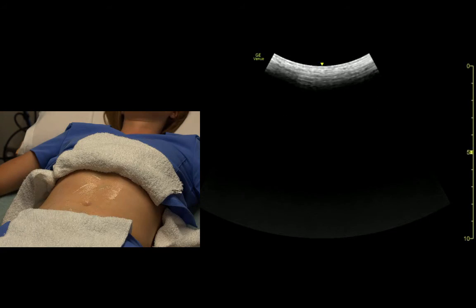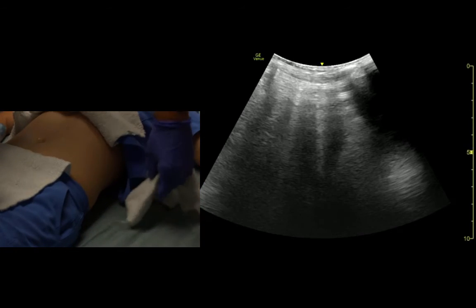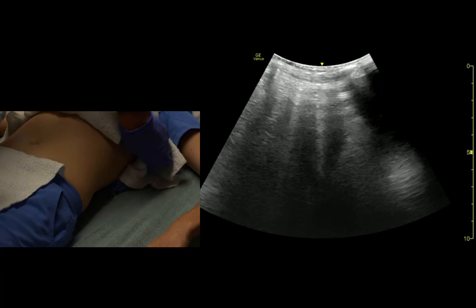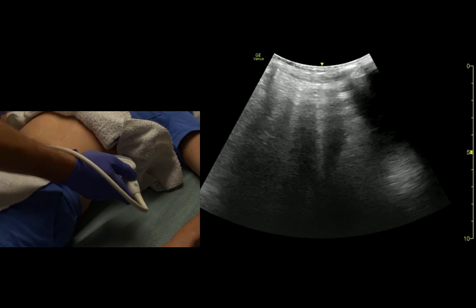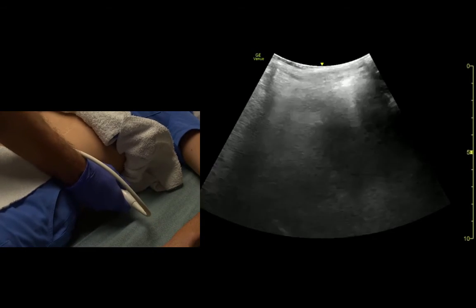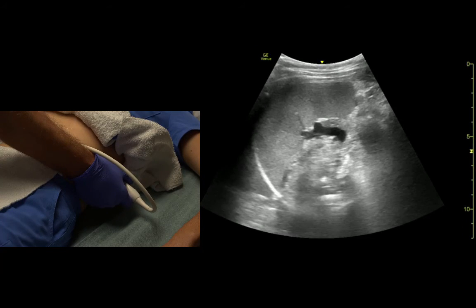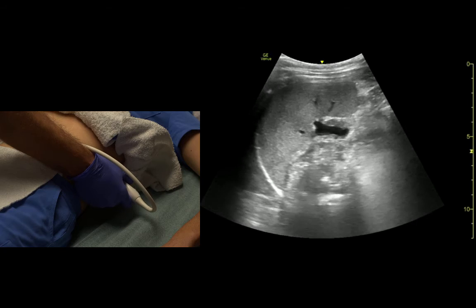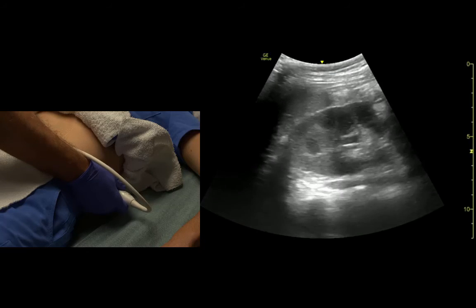Now coming over to the spleen on the left side — we come pretty much across from the xiphoid, indicator at about one or two o'clock, almost backhand on the bed. We can see the spleen underneath the diaphragm. And if we fan posteriorly, there we see the kidney.